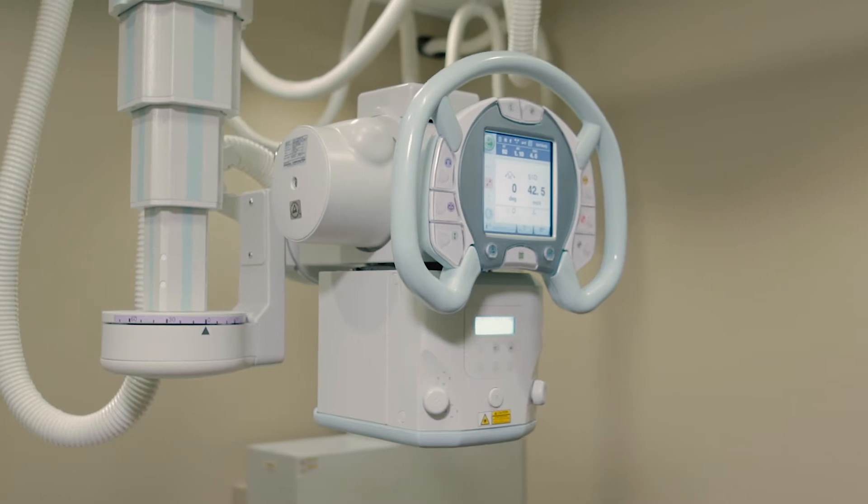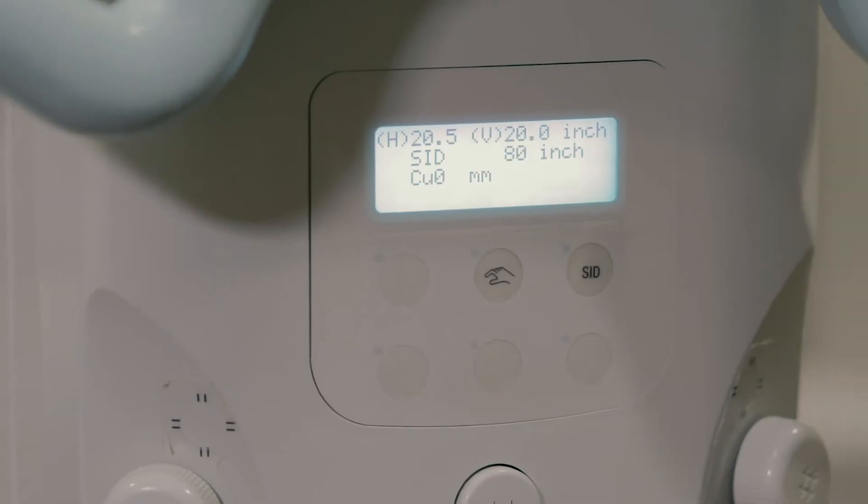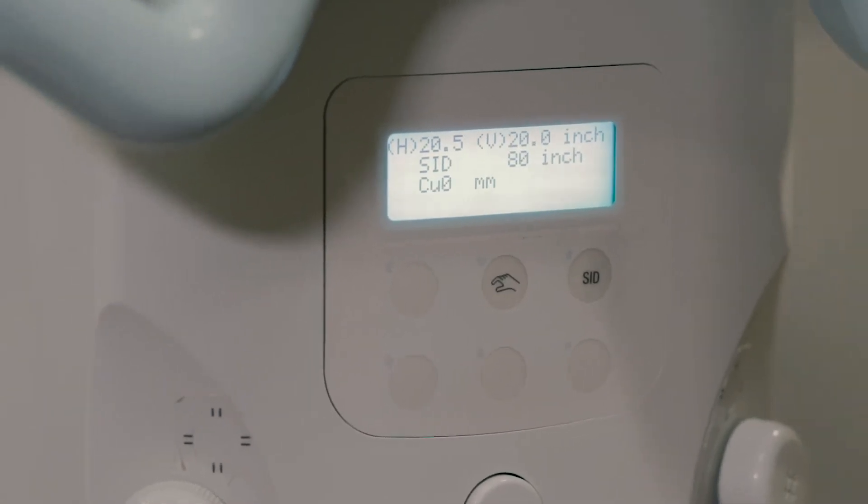Shimadzu, being a radiography-centered company, goes to great lengths to design its equipment with the technologist in mind.